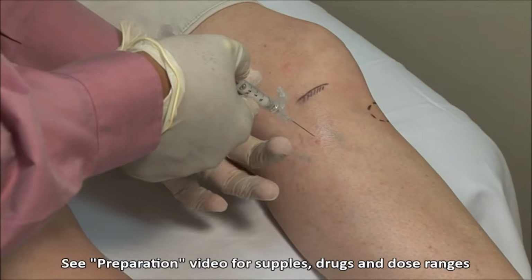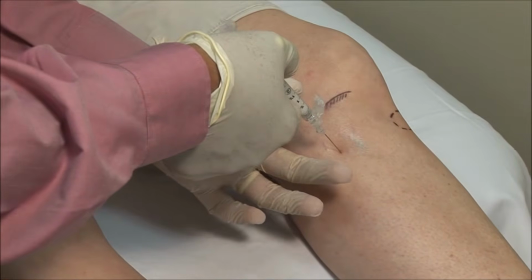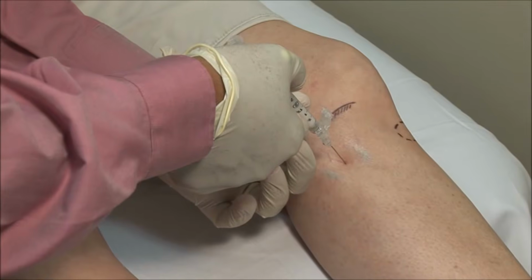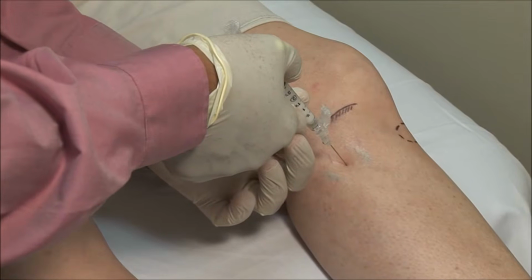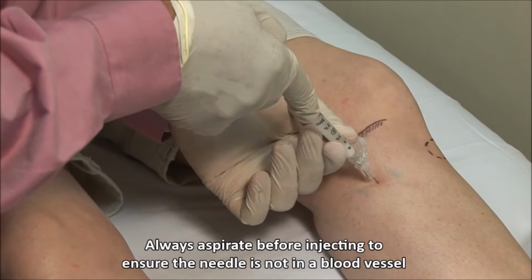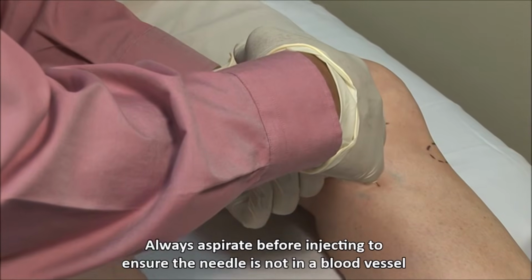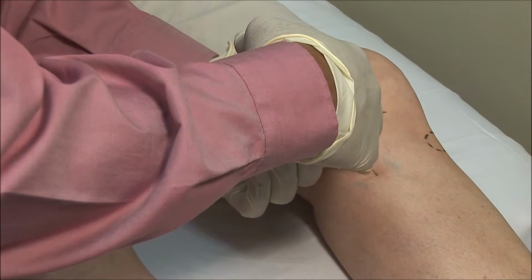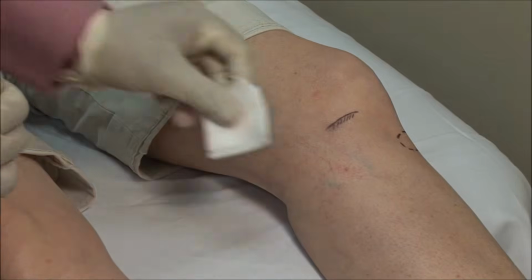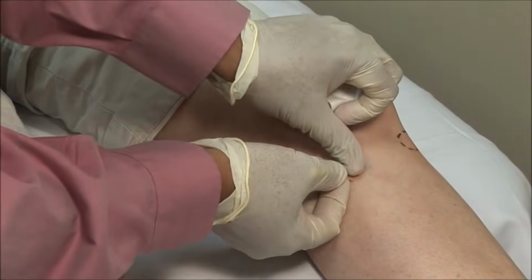Advance the needle perpendicular to the tibia, down to bone, and then withdraw about 2 to 3 millimeters. Always aspirate to ensure that you're not in a blood vessel, and then inject the solution. Finish off by drying the site and applying a bandage.